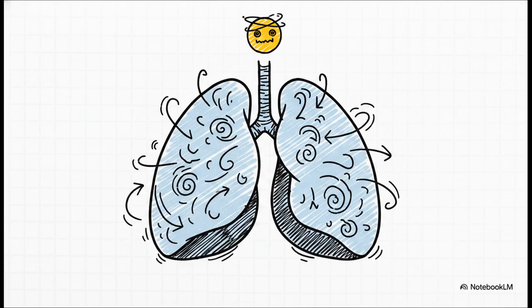But there's a catch. Because every breath the patient triggers results in a full, preset tidal volume, a patient who suddenly starts breathing really fast on their own can easily hyperventilate or trap air in their lungs. It's something you definitely have to watch for.